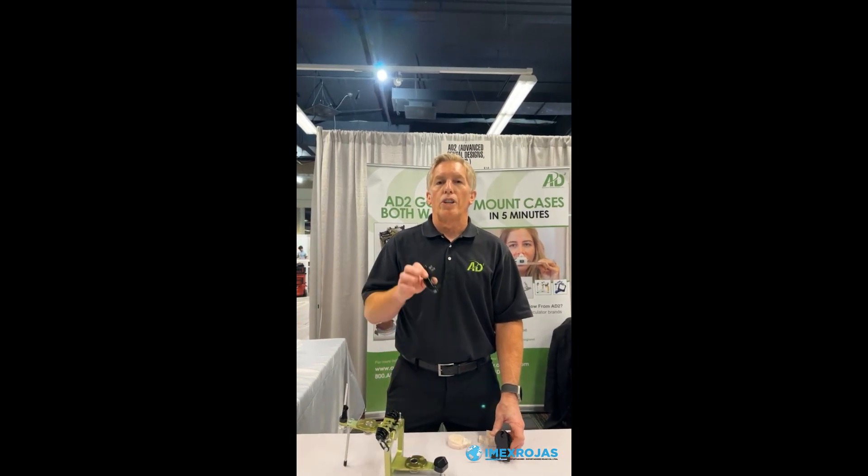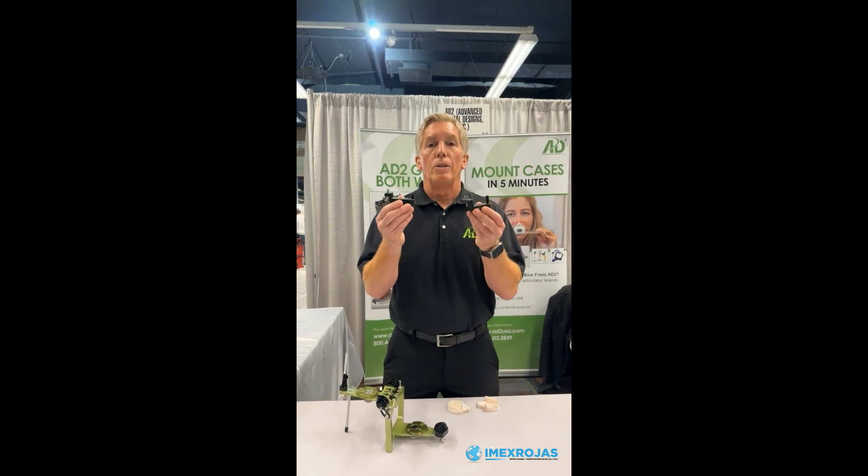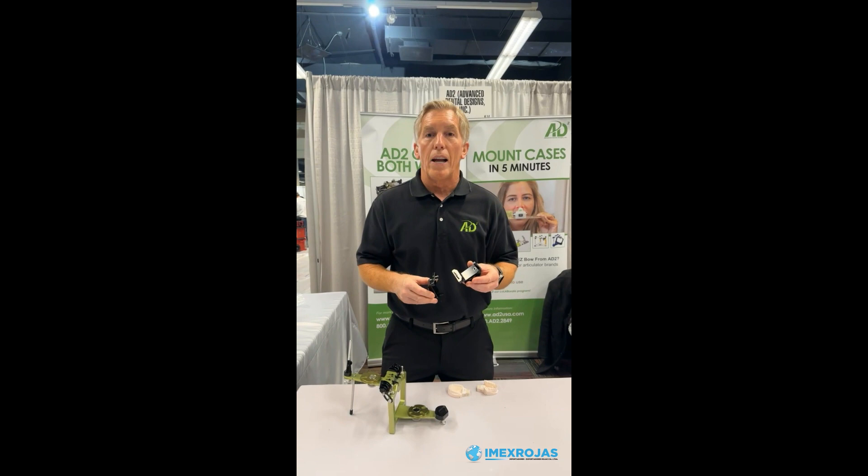This is Dave Williams with AD2. We are just finishing up a big weekend in Chicago at Lab Day, and we showed one of our newest products at the show that was a huge hit. These are AD2 digital adapters for printed models. Let's take a look and see how they're actually used.